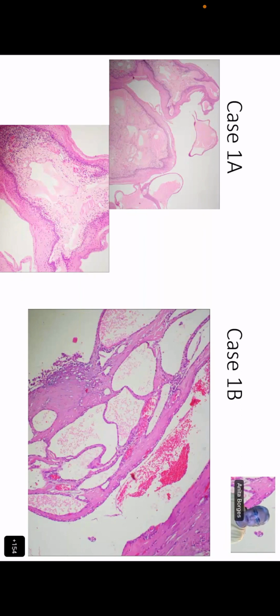Limpy, you have to answer quickly. Do you agree? Limpy is not there. So, Sumita? Yes, ma'am. I can see the inflammatory infiltrates, ma'am, but I am not sure if they are mononuclear in this field. So that's the only thing you disagree.